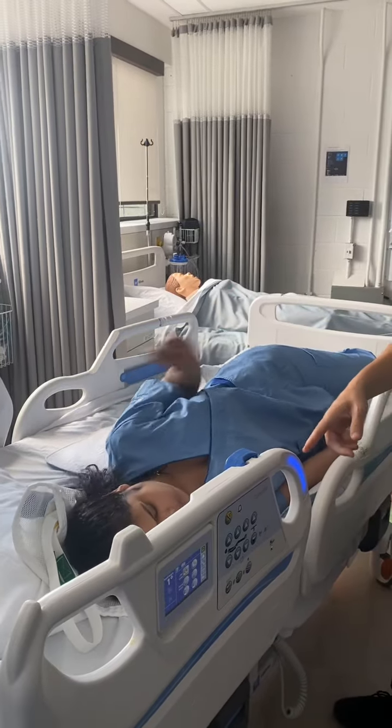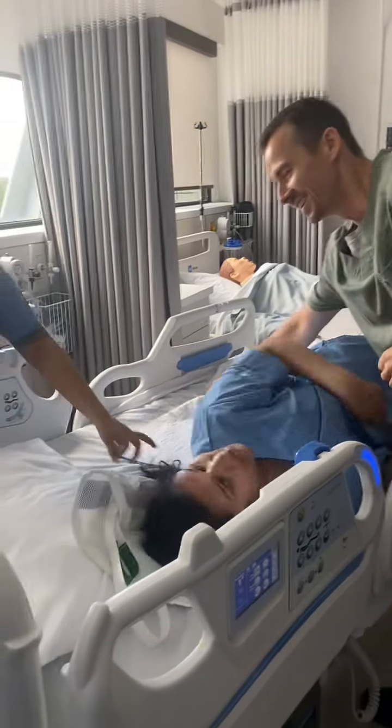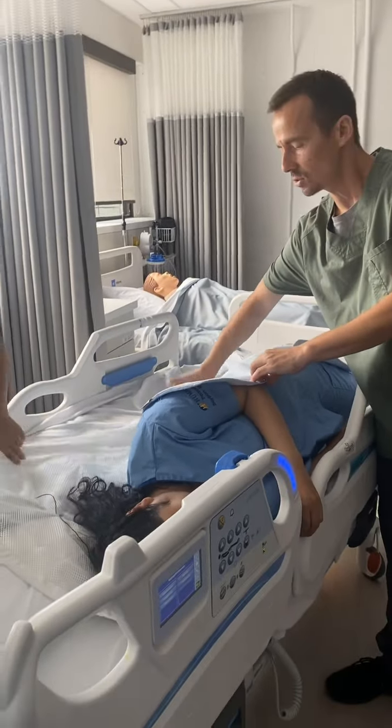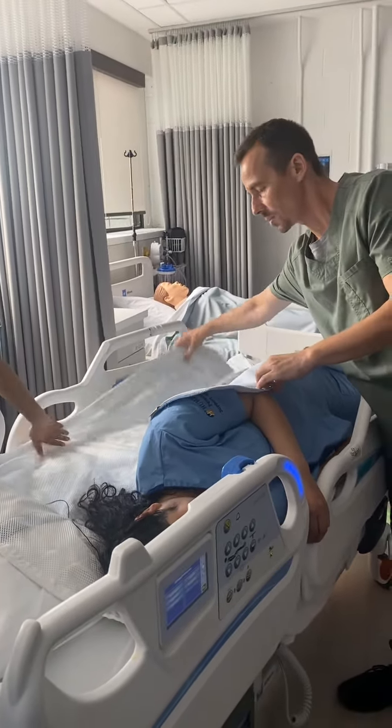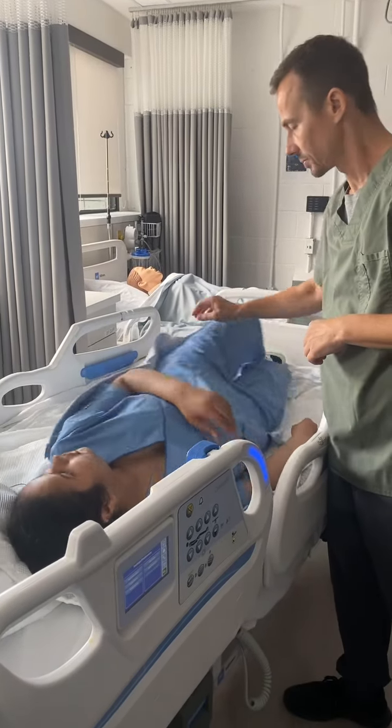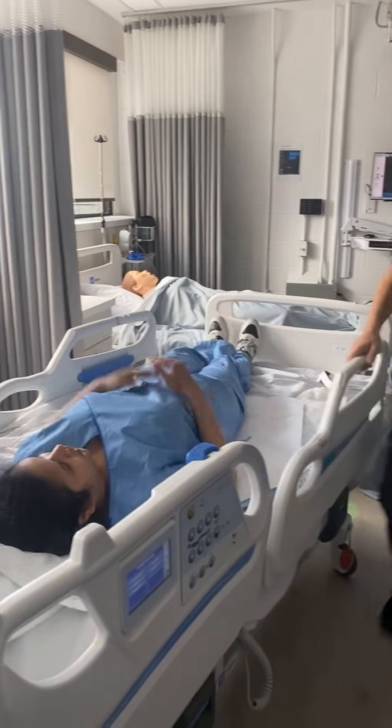Reach for it. You can try. All you need to do now is pull out this thing from the other side. Good. Turn on your back again. You can see, all right, slings underneath.